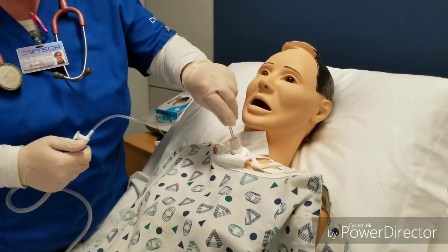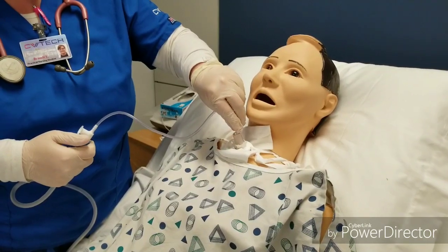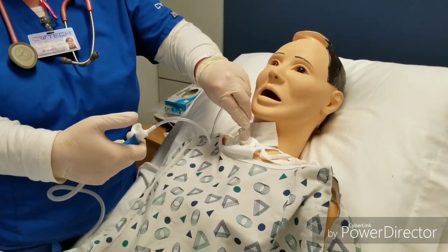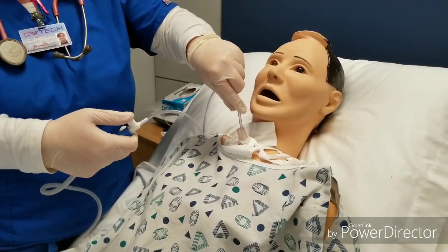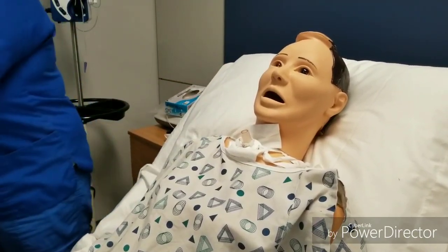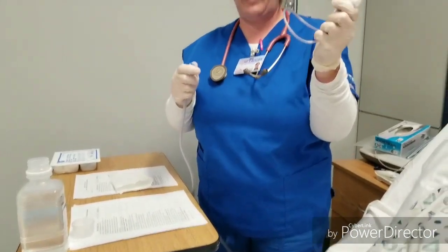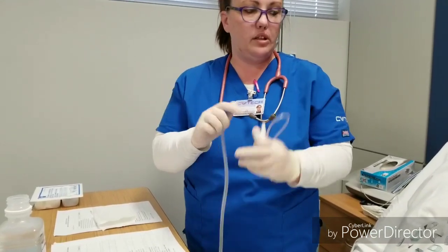Going in, just about 3 inches or so. You don't want to go too deep. And then your thumb, this is your suction, intermittent. Twirl it around. Good. Clear your tubing, and this you will throw away. You're going to peel it off in your glove, that way everything is still kept inside your glove. No issues.